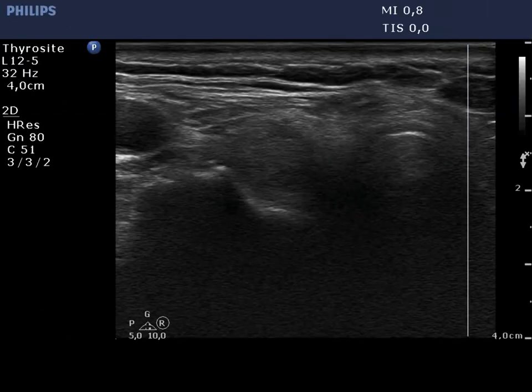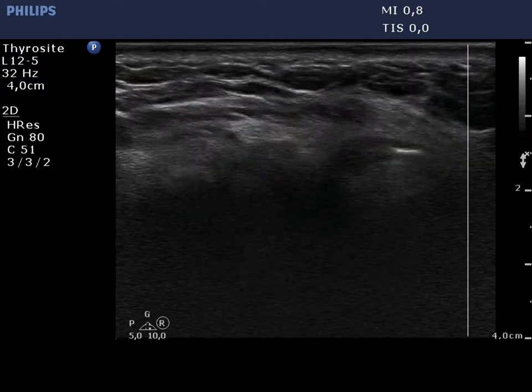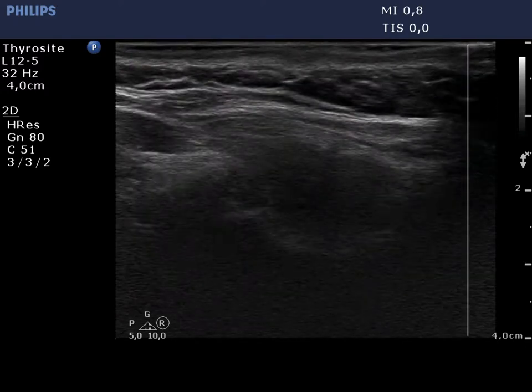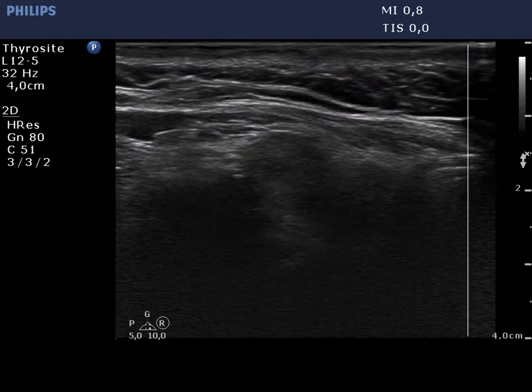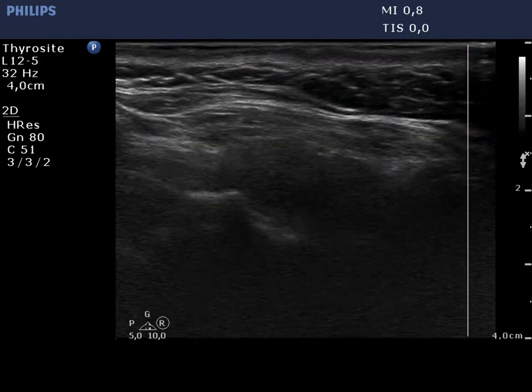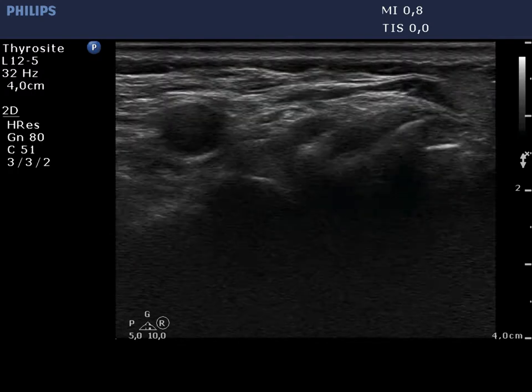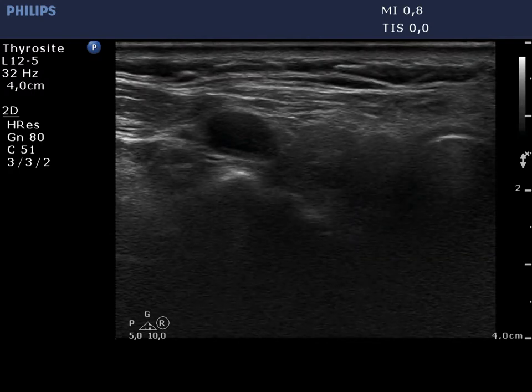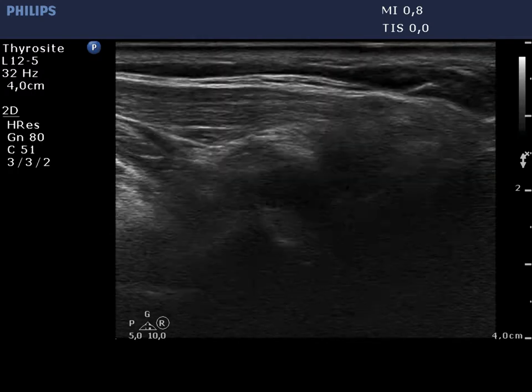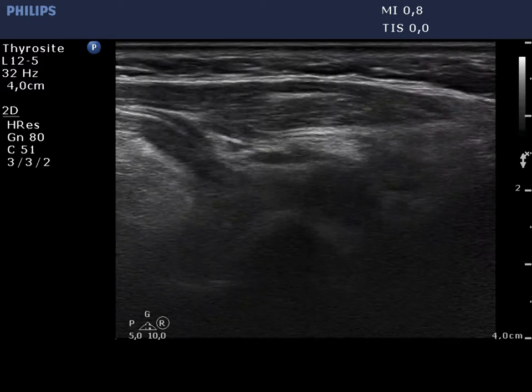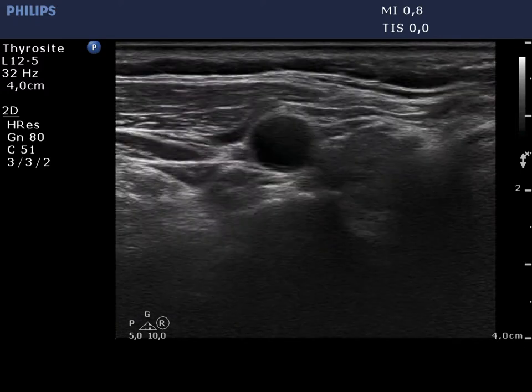The right thyroid is atrophic and moderately hypoechoic. The latter has only a limited importance in elder patients. Lower to the right thyroid there is a similar lesion which contains small cystic lesions.